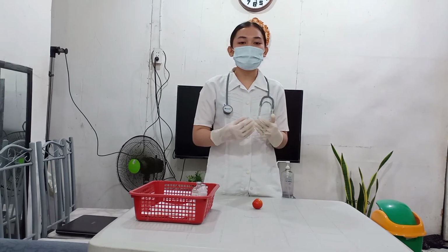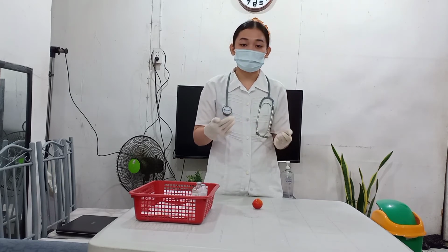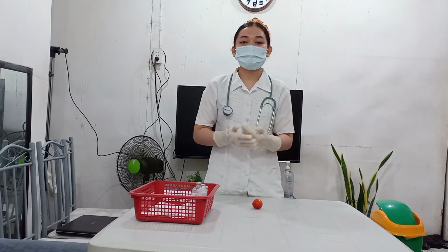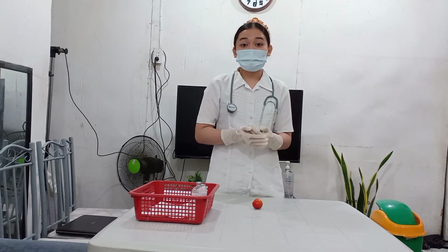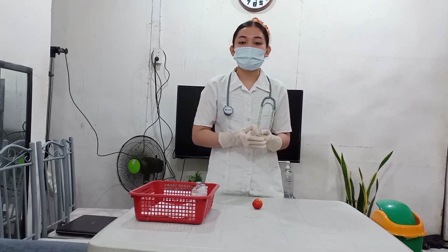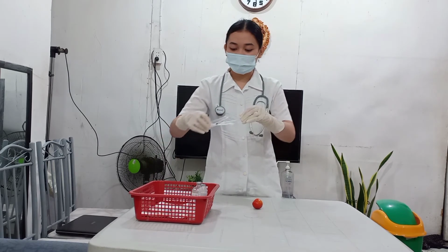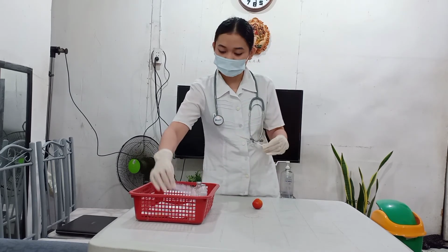And then we remove the needle cap from the syringe by pulling it straight off. This technique lessens the risk of accidental needle stick and also prevents inadvertently unscrewing the needle from the barrel of the syringe. So, I'm going to use this medication.